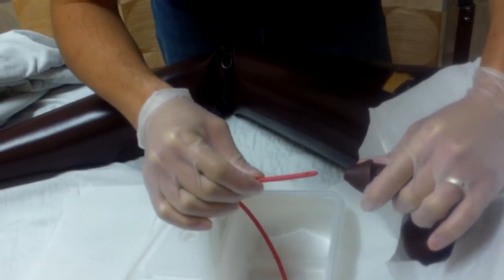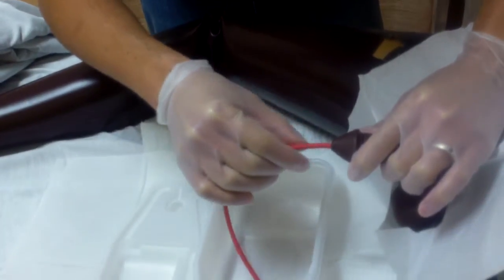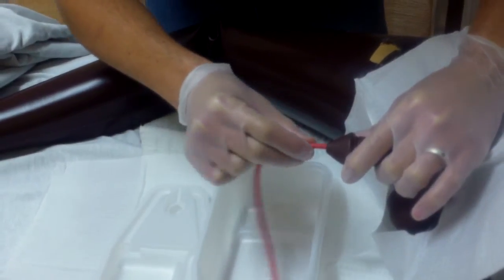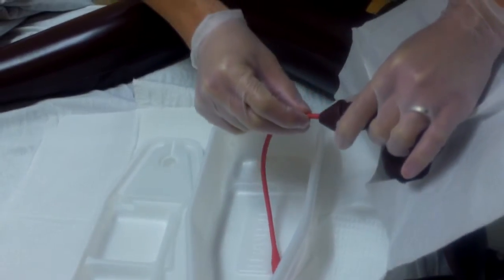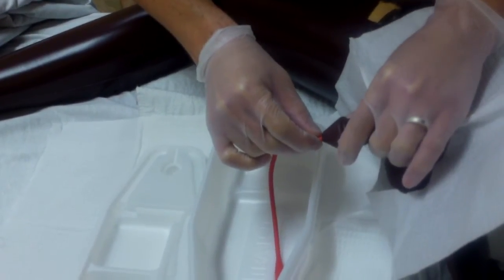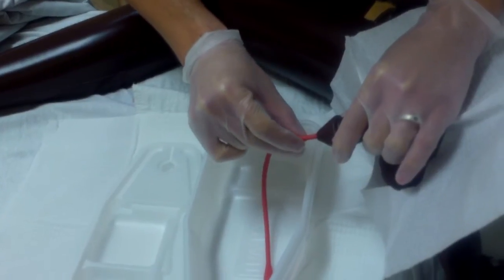So then I would open up the meatus and I would insert the catheter, and I would continue inserting probably about 5, maybe 6 inches until I get urine. And then once I do get urine, I would hold that and I would wait until all the urine is going into the basin right there. And I would ask him how he's feeling. Maybe that feels better, because then his bladder's not all distended.